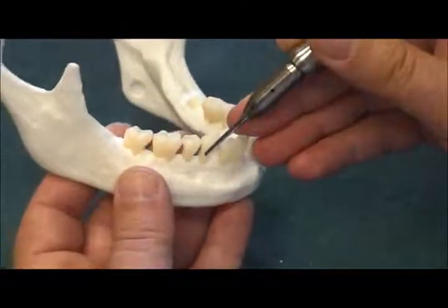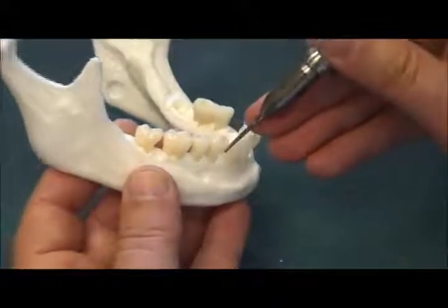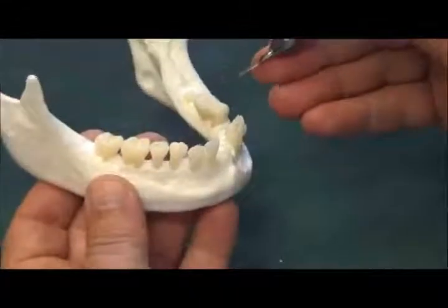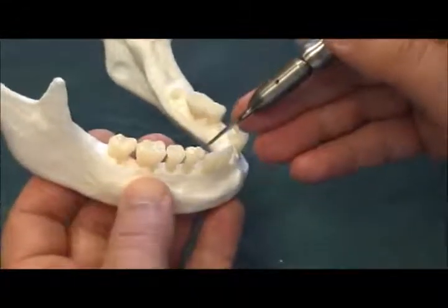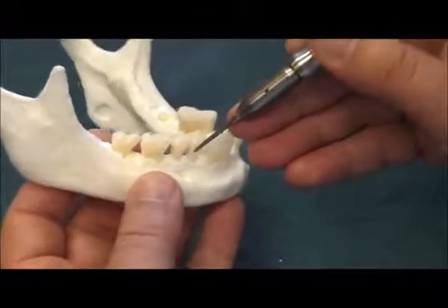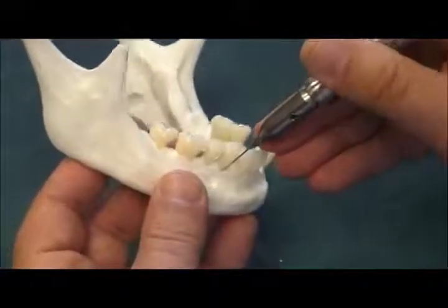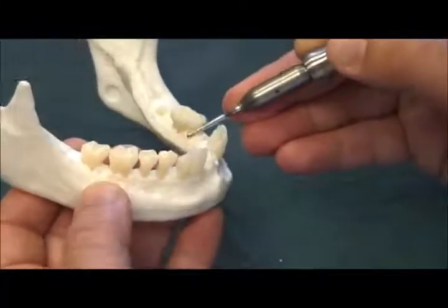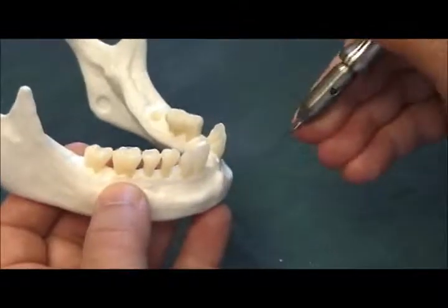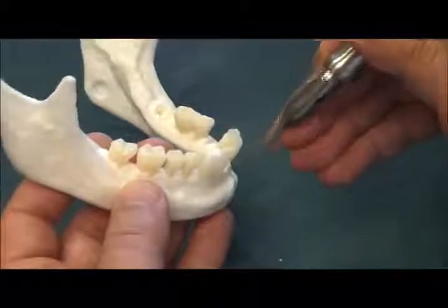The most important thing initially in using the powertome is to make sure that the tip of the instrument is actually in the periodontal ligament space. Because of that, when you start using the instrument, you want to start off with a full thickness flap and be able to visualize the crestal bone and the beginning of the periodontal ligament space. After you gain more experience, you'll be able to get into the periodontal ligament space without reflecting a flap, which is mostly what I do now.